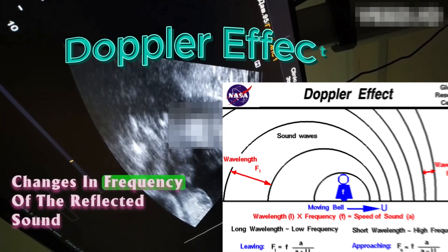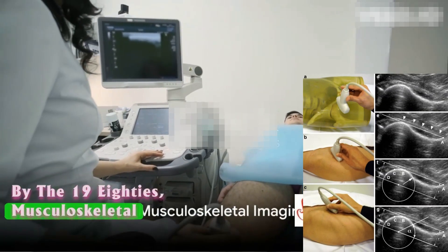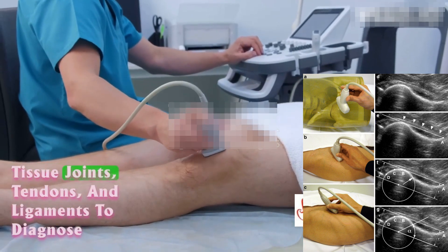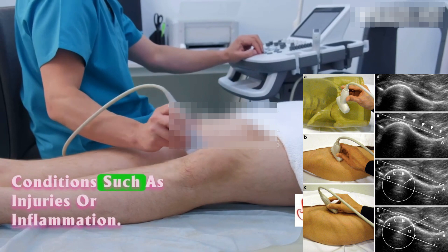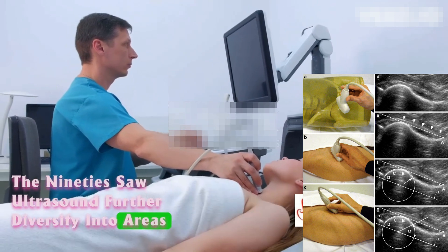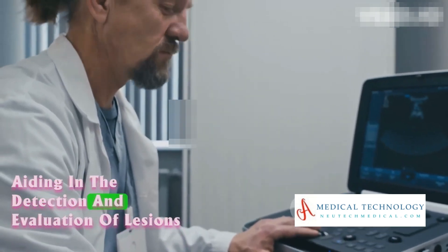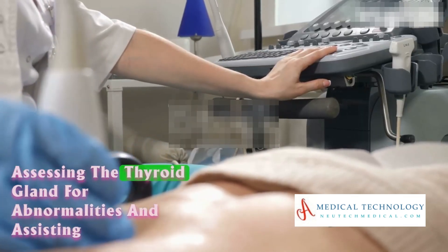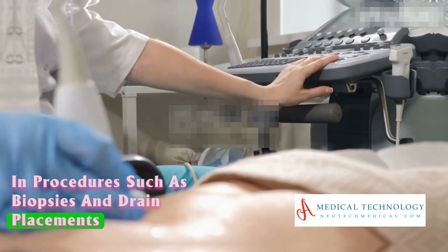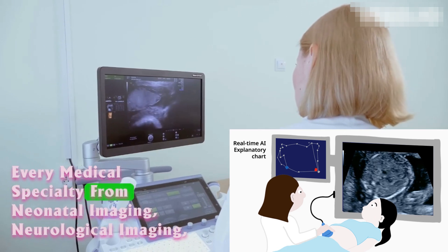By the 1980s, musculoskeletal imaging joined the ultrasound family. It was now possible to examine soft tissues, joints, tendons, and ligaments to diagnose conditions such as injuries or inflammation. The 1990s saw ultrasound further diversify into areas like breast imaging, thyroid imaging, and procedural guidance — aiding in the detection of lesions, assessing the thyroid gland for abnormalities, and assisting in procedures such as biopsies and drain placements.